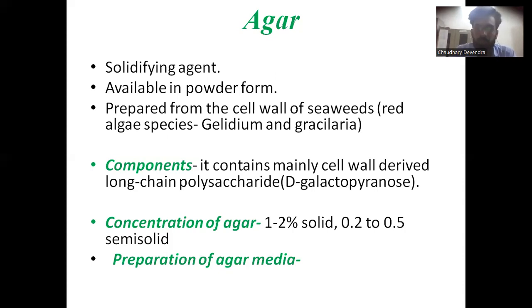If we talk about the composition of agar, we use 1 to 2%, basically we can say 2% of agar in the solid medium, when we are preparing a media.